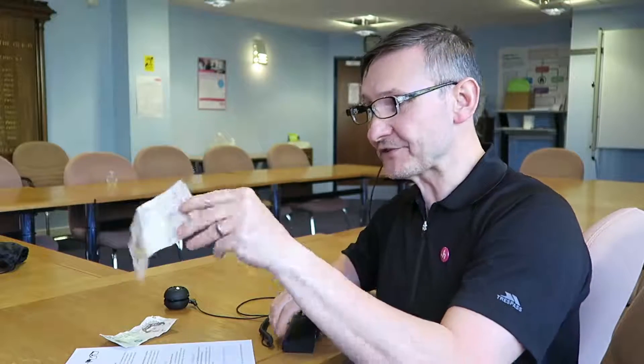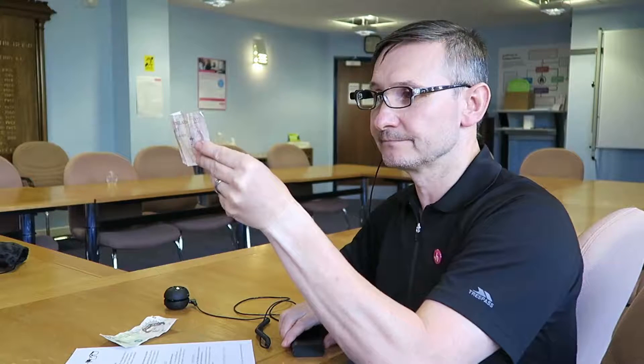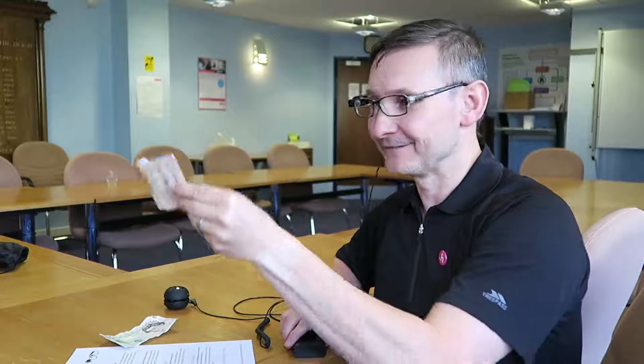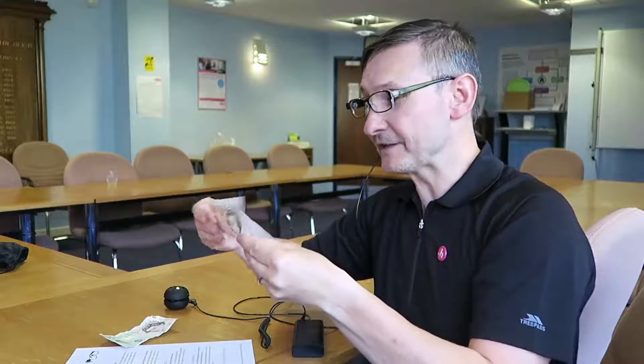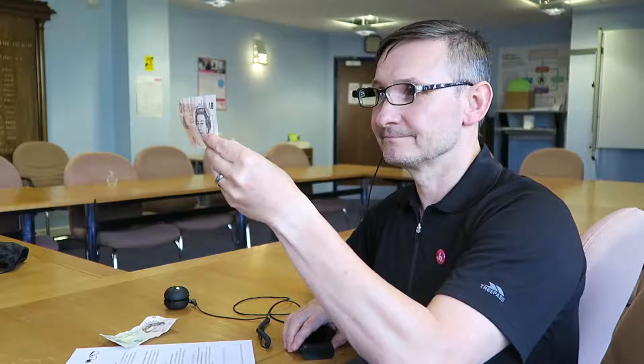I've got a £10 note here. I'm just going to look at it and press the trigger button to see what it says. It said 'pound note, please turn to other side.' So I'm going to turn it around and hopefully it'll tell me it's a tenner. 10 pounds! Yay! It does it with fivers, 20s and 50s, but I've never seen a 50 so I wouldn't know if it works with that. It's not perfect but it's pretty good.